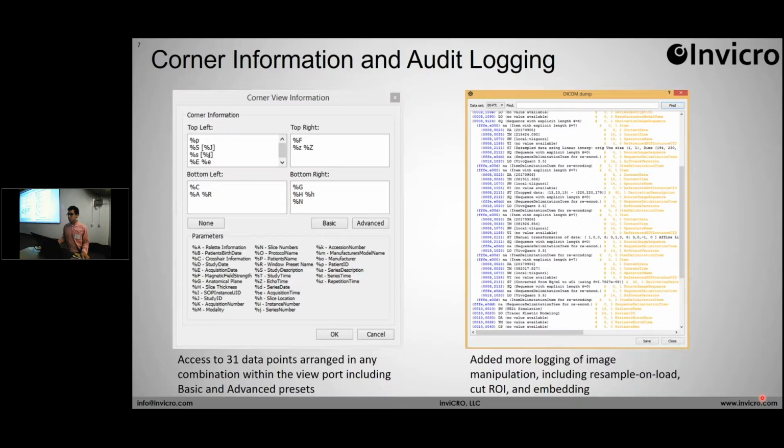And then, in addition to that, adding to what we do in the DICOM header already, which if you haven't seen this before, whenever we create a derived image in VivoQuant, we produce a log using the DICOM derivation image sequence tag, which records the username that you're working with, the timestamp, the version of VQ that you're on, as well as details of exactly what the derivation entailed, whether it be the filtering algorithm and its parameters, or the reorientation matrix, or things along those lines.